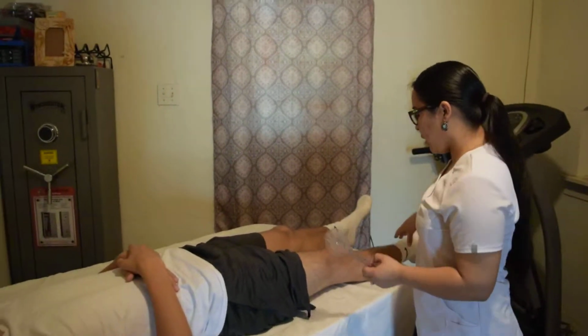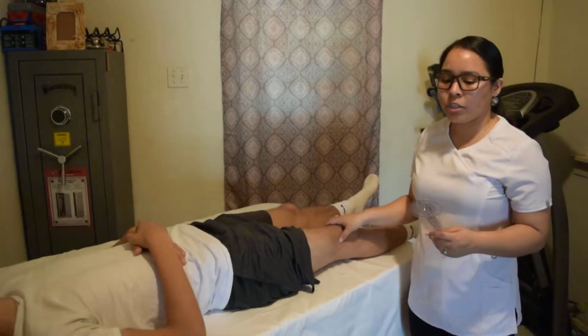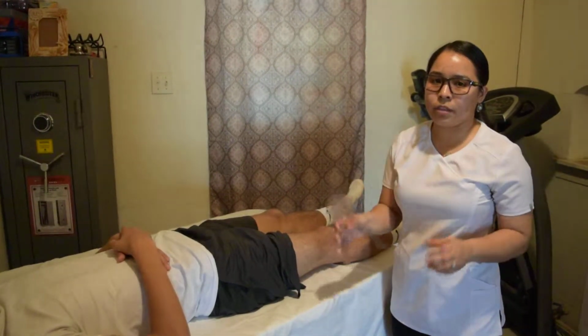So this here shows the flexion and extension and how to measure with the goniometer.